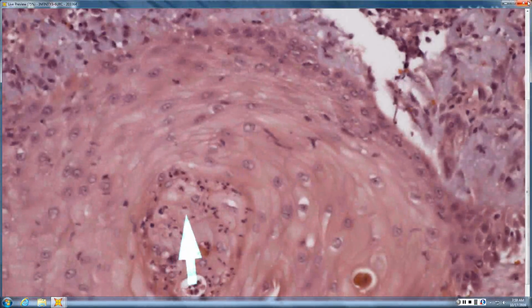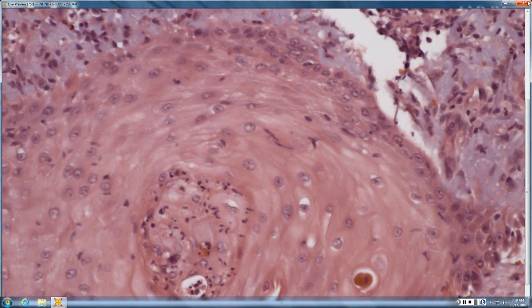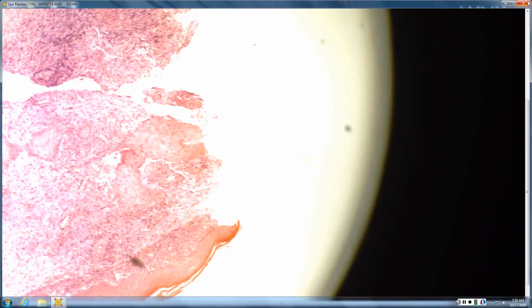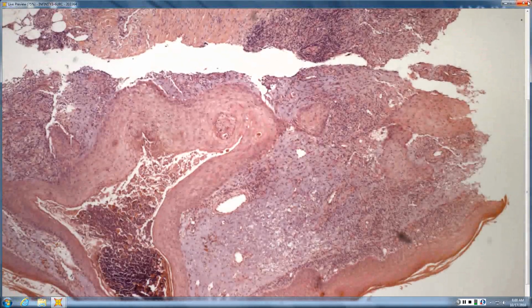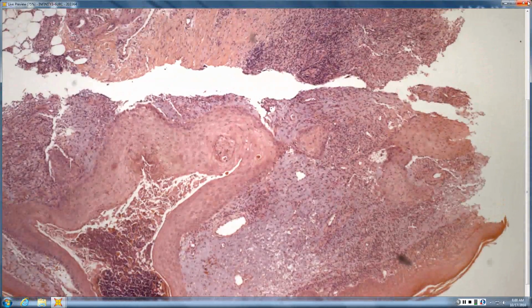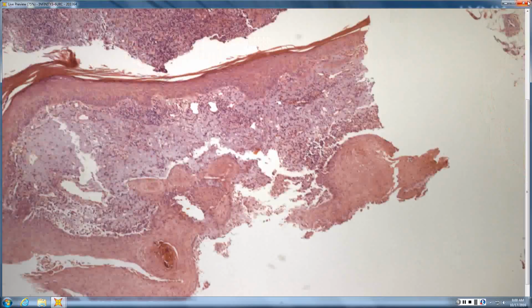It's almost infectious. So what kind of pattern do you see here? It's very follicular. You're pointing at neutrophils, probably more neutrophils, yeah. Neutrophils in your epithelium. It's glassy and degenerated. Yeah, pseudoepitheliomatous hyperplasia. PEH with pus. So the mnemonic is here comes big green leafy veggies.